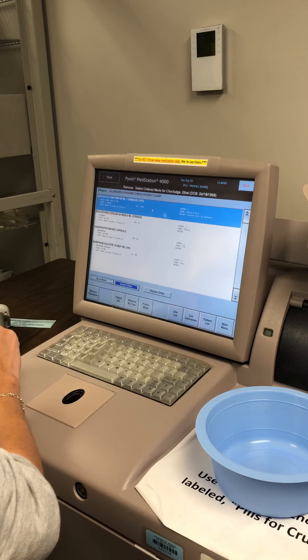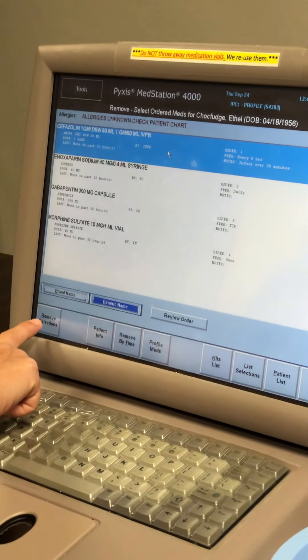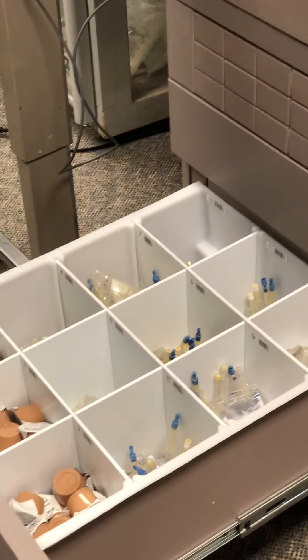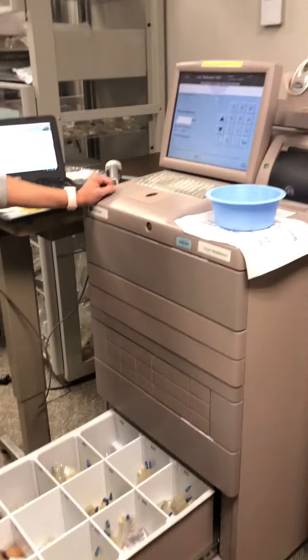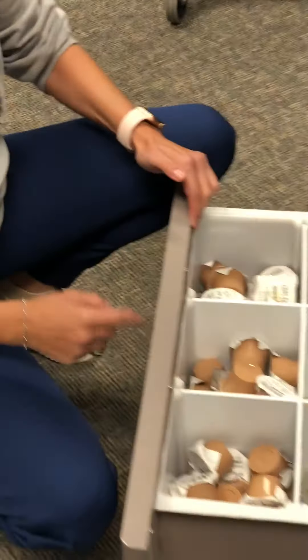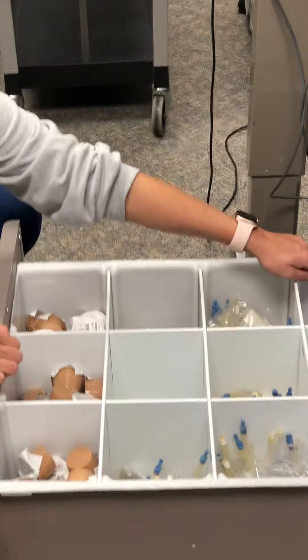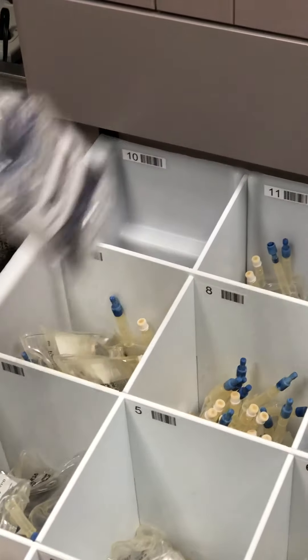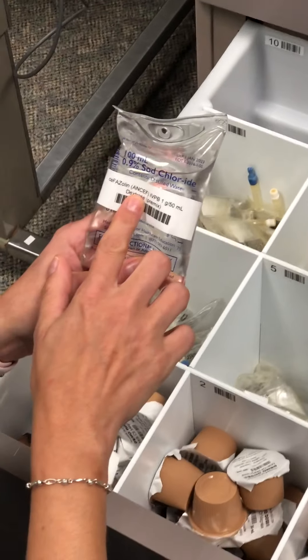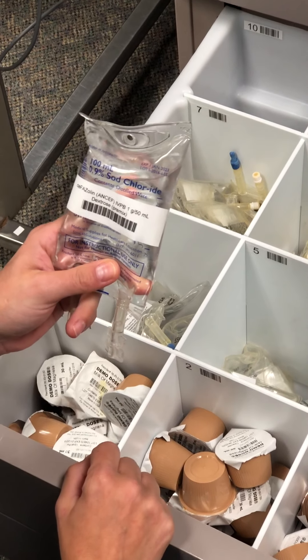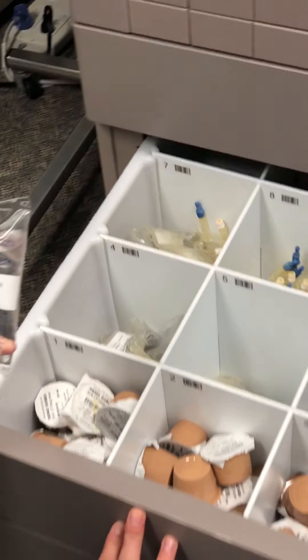I'm going to select it with my finger and I'm going to hit Remove Selections. It's going to pull out. You have to look to see drawer five, pocket ten, and you want to make sure we've got drawer five and then pocket ten. There's a little number right in here to the left in the top corner. I'm going to look in here and make sure this med is ANSEF one gram in 50 mils, ready to go, before I shut this door.